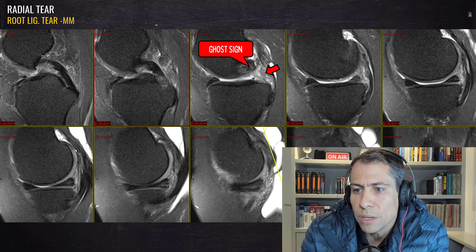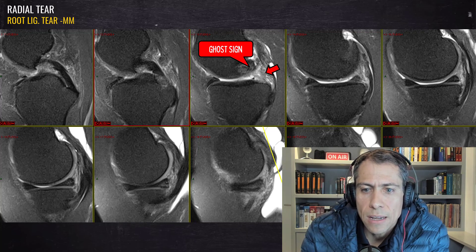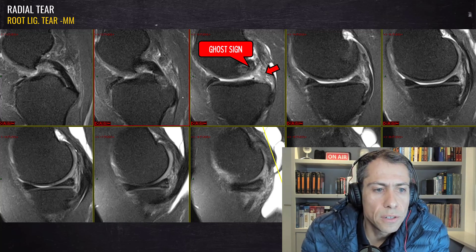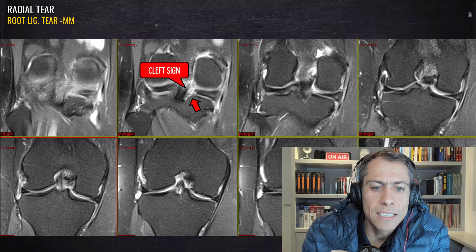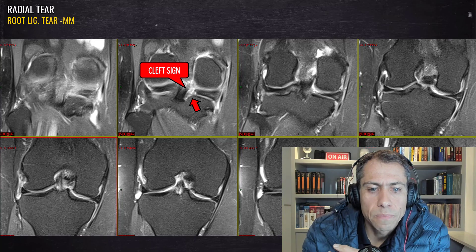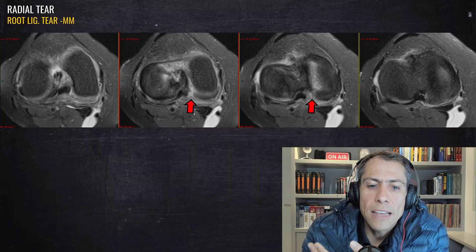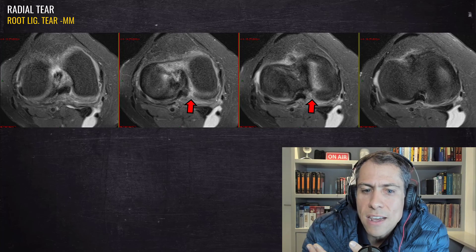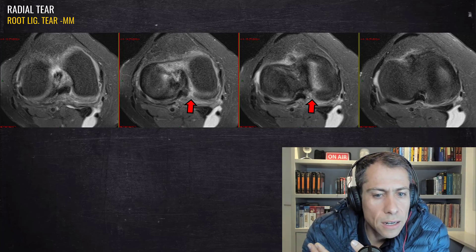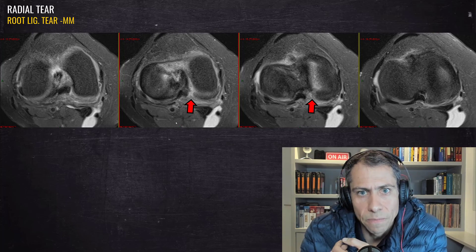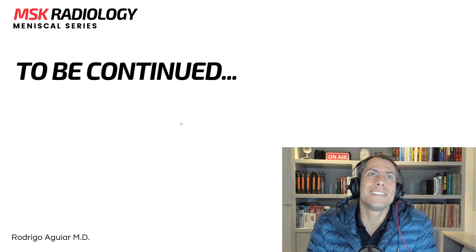Here we can see the posterior horn of the medial meniscus, and at this level we cannot see the junction between the posterior horn and the root ligament. We can see one part of the root ligament here, and here is the radial tear of the posterior root ligament of the medial meniscus. On the coronal plane, there is an area where no meniscal tissue is visible — this works like a cleft sign. On the axial plane, we can clearly see the tear at the posterior root ligament.